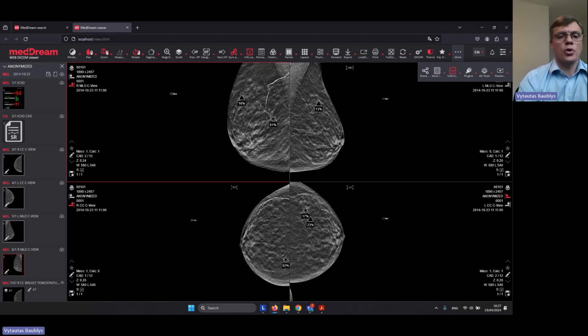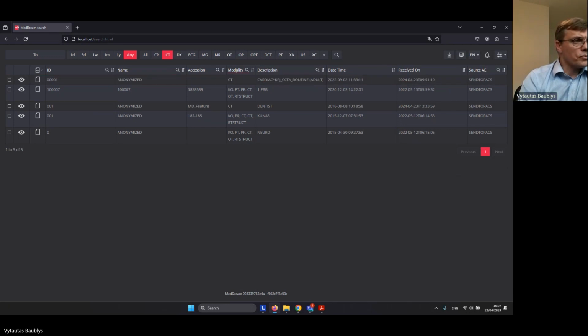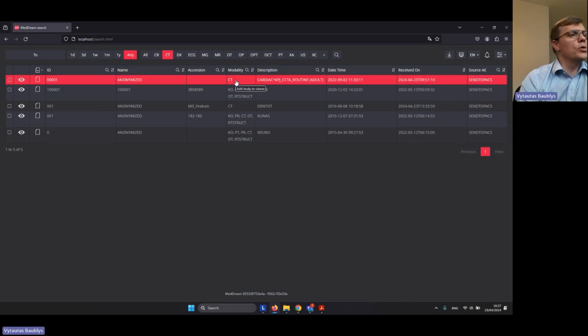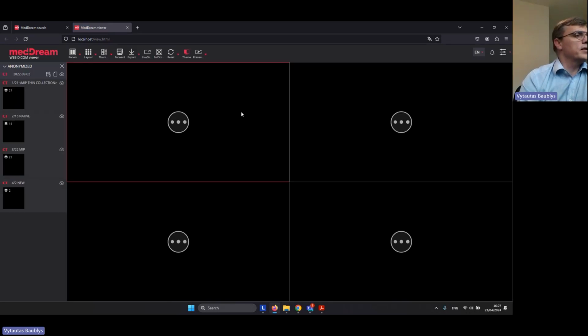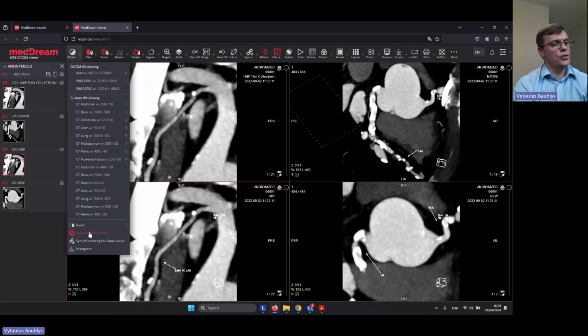Let's try to open now the overlays, which was also asked by many companies, especially those which do lungs overlays and other stuff. So here now I have the overlay. In this case, the overlay is just a simple marker which shows some findings. So here I can enable or disable. Now I removed it, so there is no overlay, clear image. But as I said, you need to go image by image, and whenever you don't need it, you just unmark.